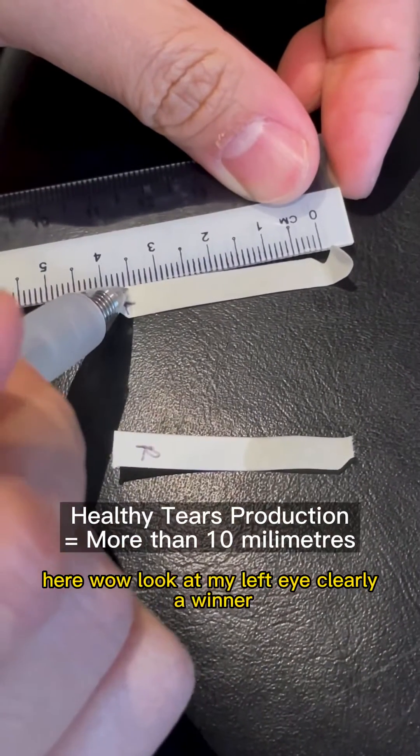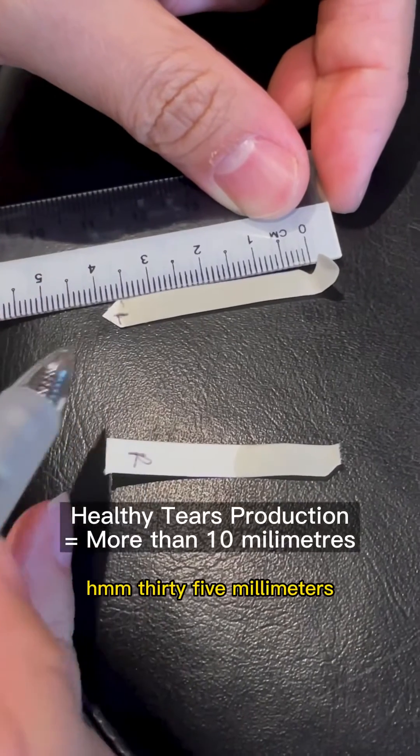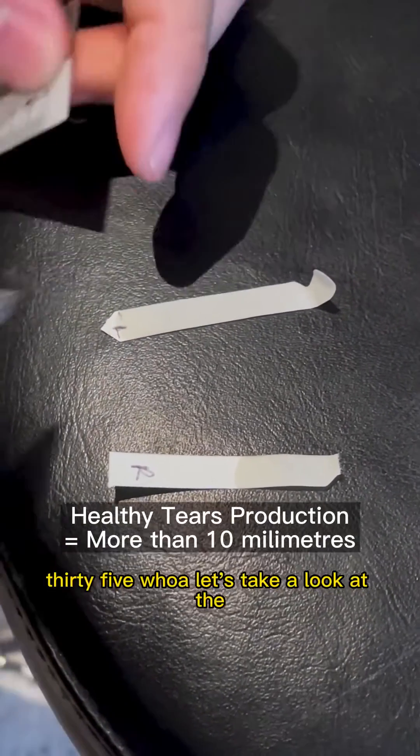Wow! Look at my left eye — clearly a winner! 35mm! 35! Whoa!